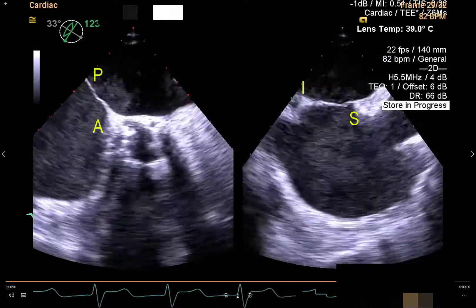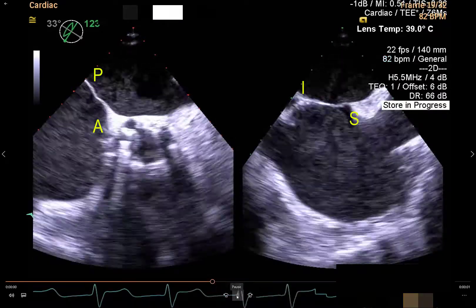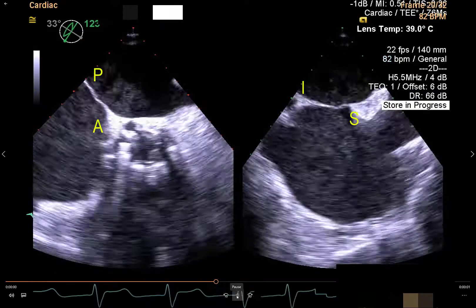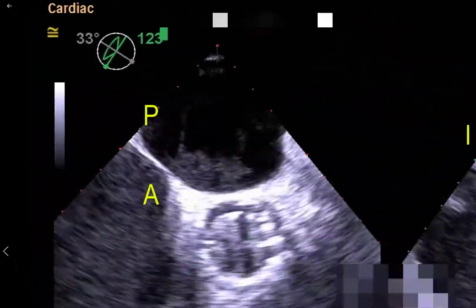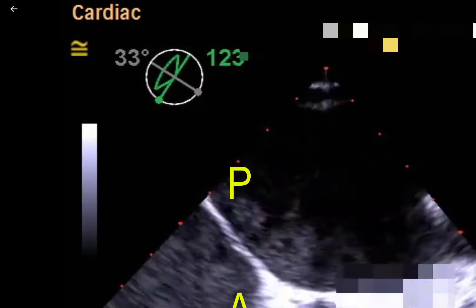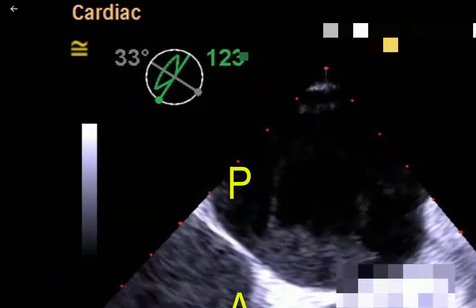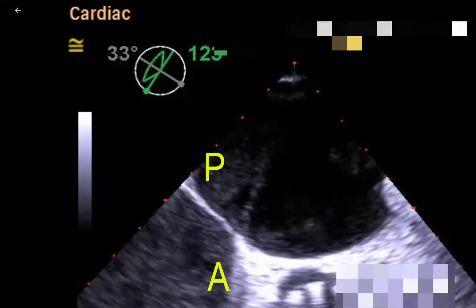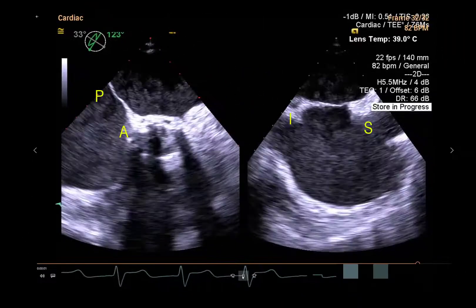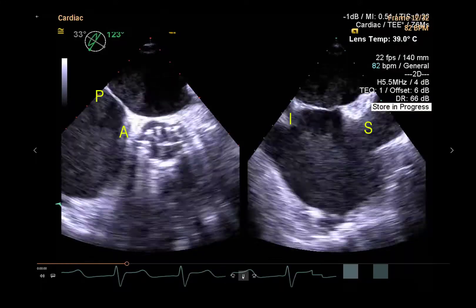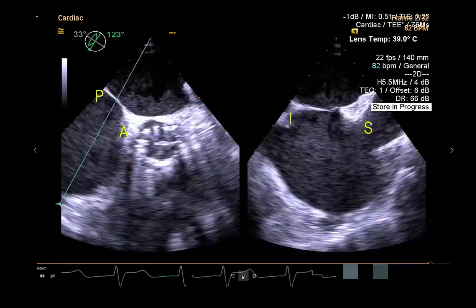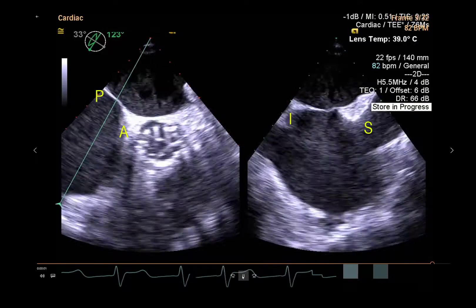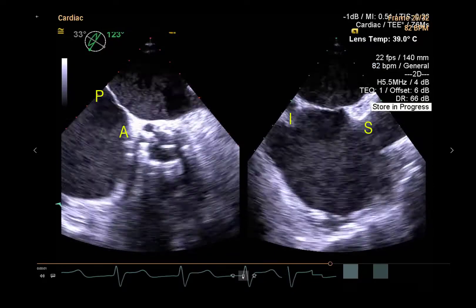The anteroposterior rim is being seen in the reference plane at 33 degrees of scan plane rotation, and the lateral plane showing the superior and inferior rims is seen at an orthogonal rotation of 123 degrees. These views must be practiced multiple times before the start of the actual transeptal puncture.